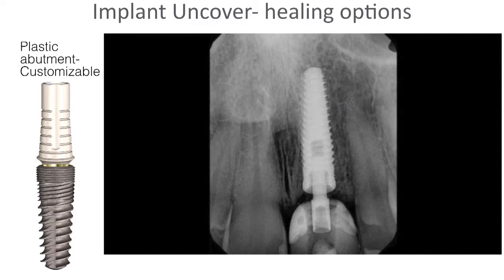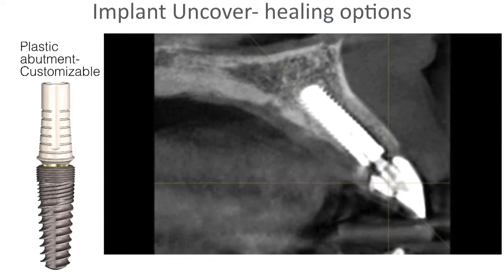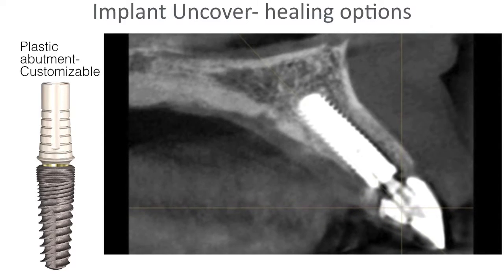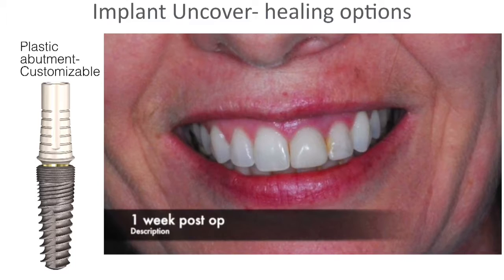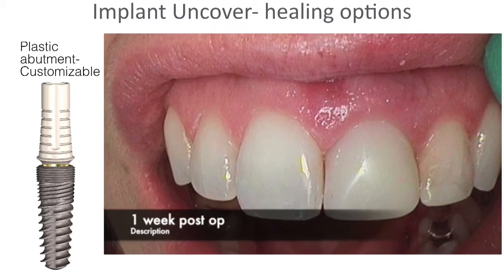The plastic part in the middle that looks like it's empty is actually the plastic abutment. It doesn't show up on the X-ray very well, but you can see the metal housing on the inside of it. This is our implant in place, and this is her 1 week post-op. You can see the tissue looks beautiful on the area. Using the plastic customizable abutment.